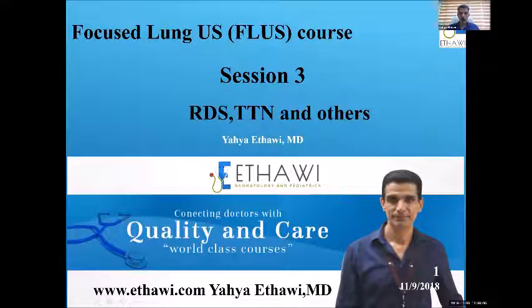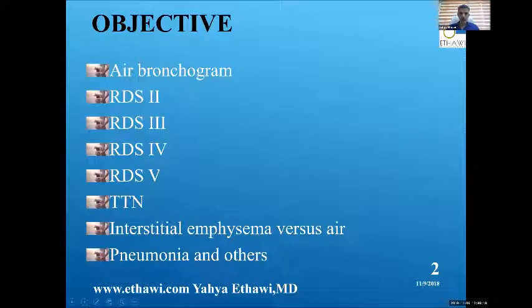Welcome to the third session of the focused care ultrasound, and it will be about RDS, TTN, and some other problems. So the objective, we will speak about air bronchogram, and then we'll categorize the RDS according to the ultrasound finding, and we'll talk about TTN and other problems encountered during the use of lung ultrasound.